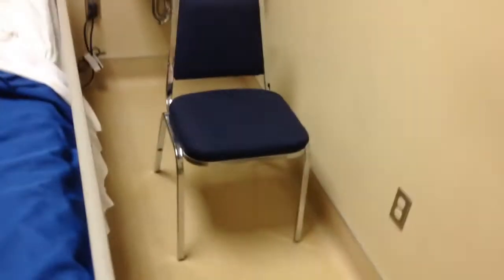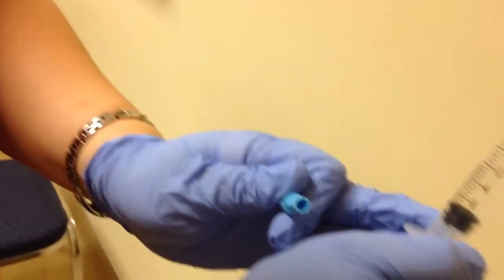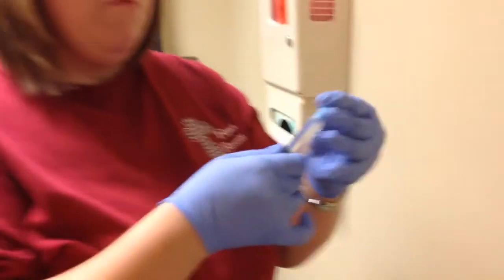So I'm going to go pour this over the garbage can. I need 5 milliliters, so I'm going to get my excess out of here. Okay, so I've got 5. And just keep in mind, students, that it's always better to over-dilute a medication than under-dilute it because of the way that it can affect the veins, okay? Alright.